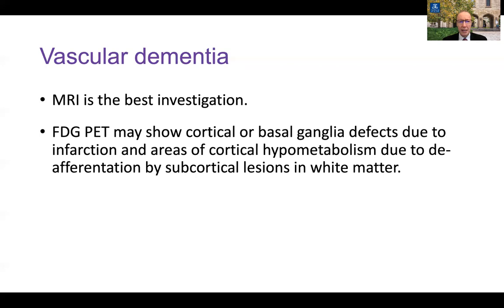For vascular dementia, FDG PET is not particularly useful — MRI is the best investigation for documenting the vascular contribution to cognitive impairment. FDG PET may show cortical or basal ganglia defects, and it's important to look for small defects in the basal ganglia and thalamus that could support vascular dementia. You may also see cortical hypometabolism due to deafferentation of the cortex from subcortical white matter lesions, often seen in the frontal lobes, sometimes in addition to Alzheimer's-type findings.